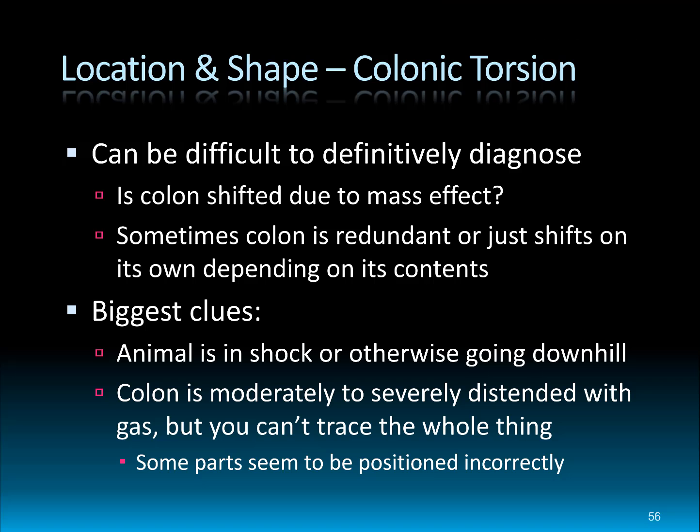The important thing to remember on colonic torsion, even though it's important to try to make that diagnosis, this is a tough diagnosis to make. These are a lot of times pretty tricky. And so you have to have it on your radar. You have to think about it. You know, is the colon shifted for some other reason? Is it a mass effect? Is it redundant colon? Or might this be a colonic torsion?